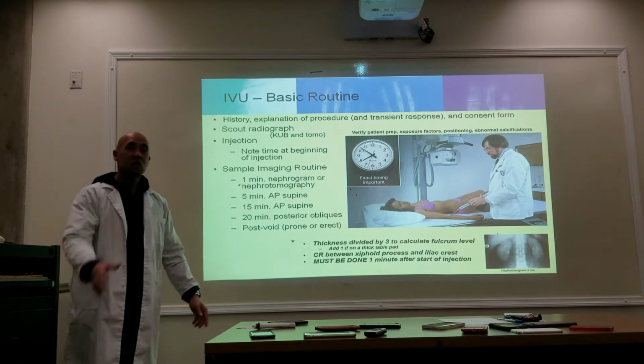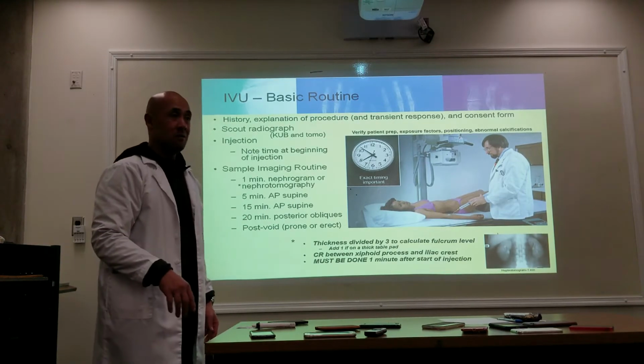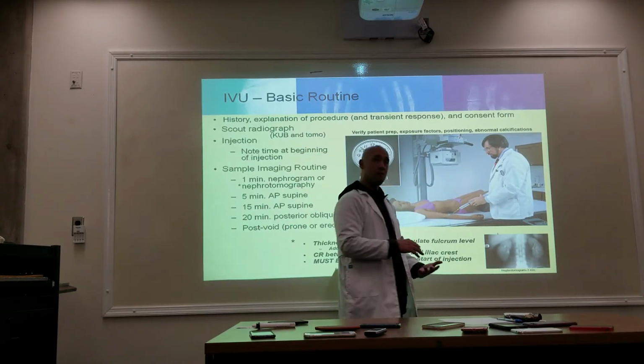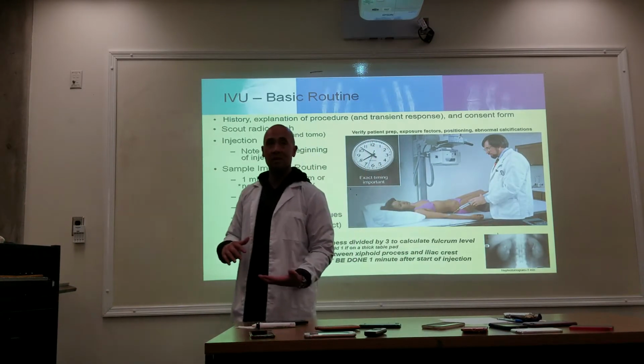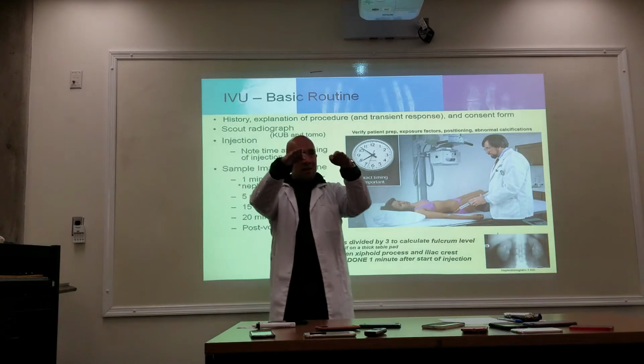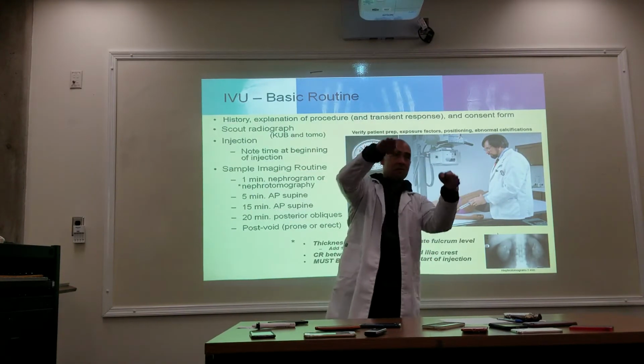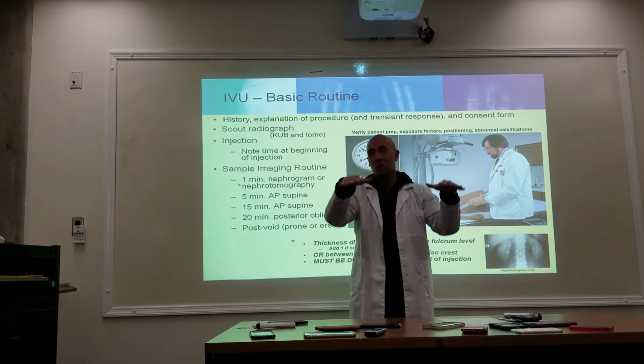Then at 20 minutes, you're going to do your obliques. Full KUB obliques. You're going to do your RPO. You're going to do your LPO. What is the purpose of the obliques? Remember how your kidneys lie? So, RPO, LPO, to get your kidneys in profile at 20 minutes.